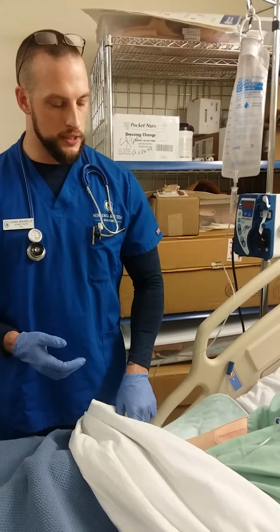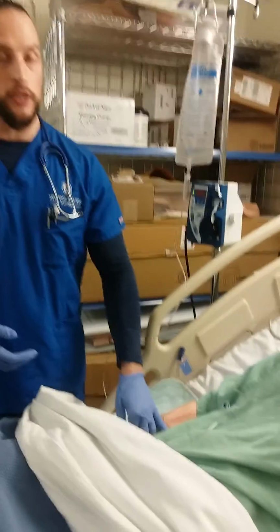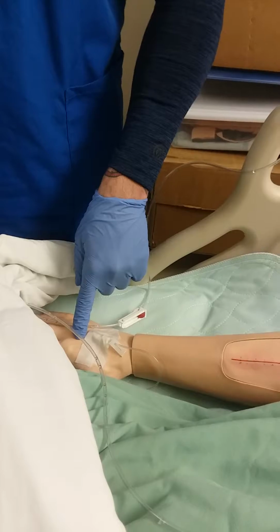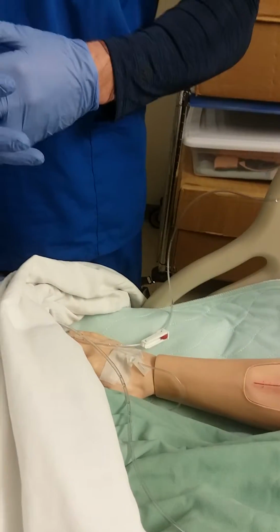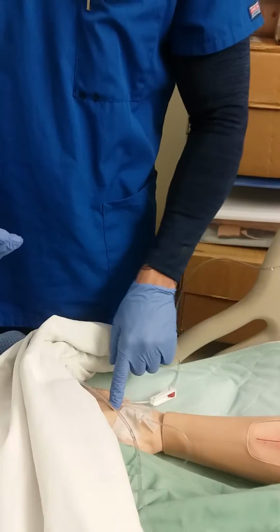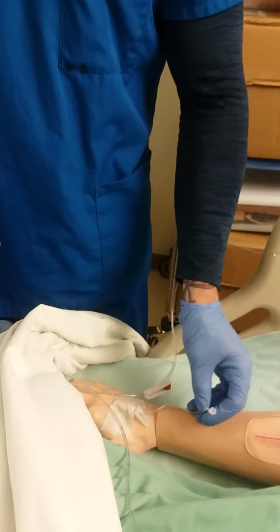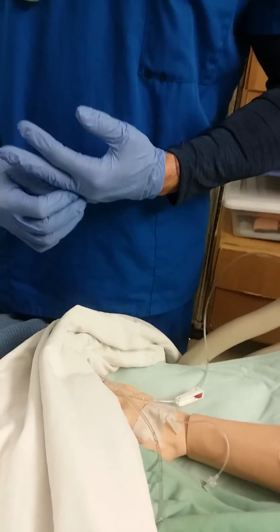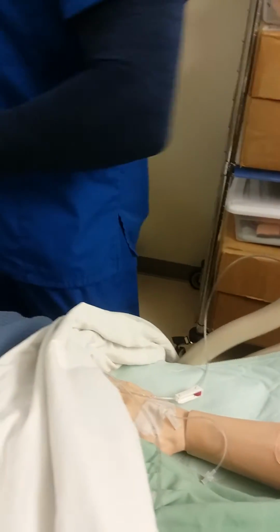I'm also going to assess the patient's IV site for any sort of swelling, bruising, pain, tenderness, inflammation, or infiltration of the site. So the site looks fine. And then I'm looking at the tubing as well, making sure it's not kinked, there's no blood in it, and it's intact.